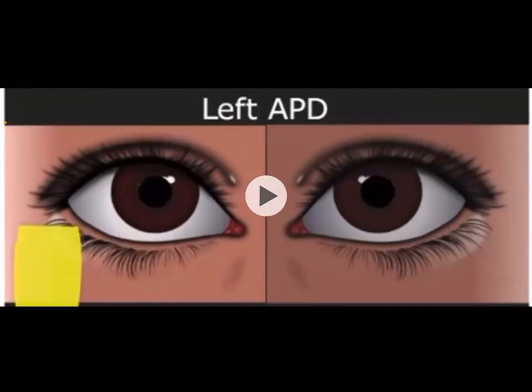Okay. Then instruction. Please choose a spot on that wall. Keep looking at it, and I will need to come closer to you. Okay. Is it okay if I put my hand on your shoulder? He will tell you yes. By the way, some tutors might tell you do not touch the patient, do not put your hand while performing ophthalmoscopic examination. But believe me, it will be very difficult if you do not put your hand.